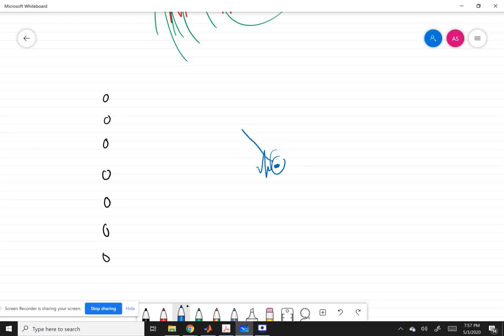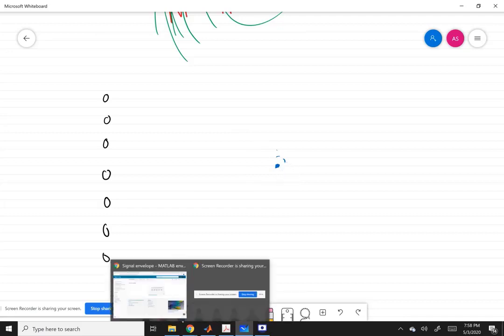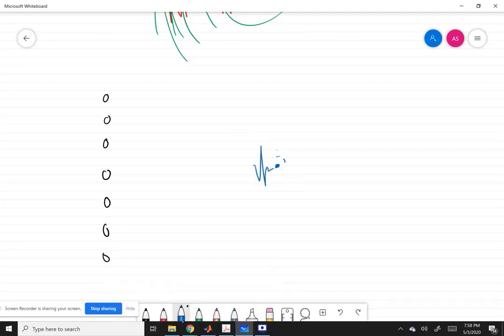So this spherical wave will propagate from this point. Okay, and the shape of these waves which are transmitted from this place are also Gaussian modulated sine waves. Now let's assume that a single Gaussian modulated sine wave is traveling from this point. Then what will happen is this wave will travel from this point to this point.